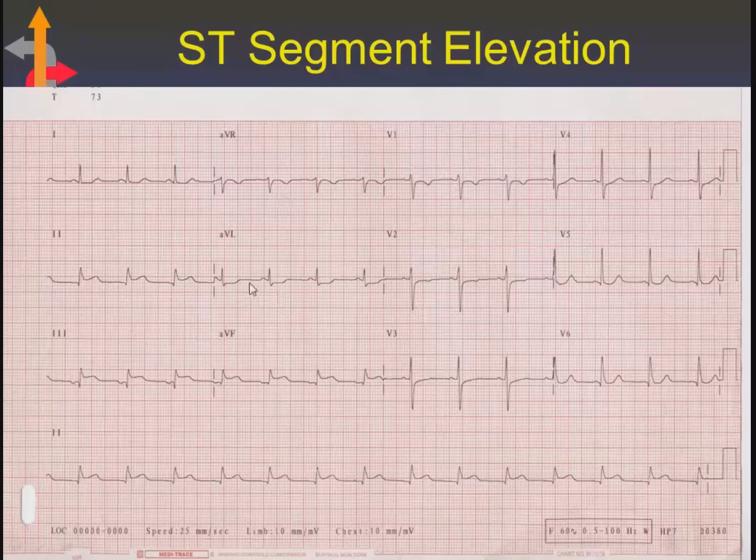AVL? It's depressed, isn't it? AVF? Elevated.